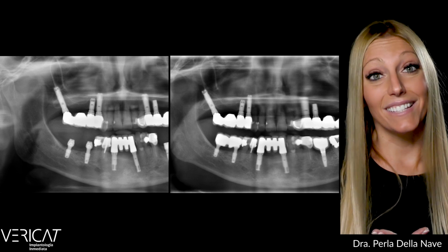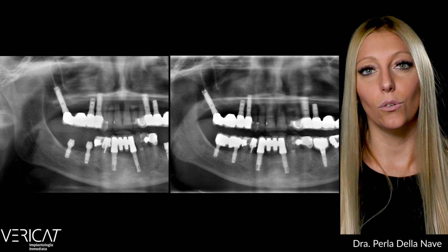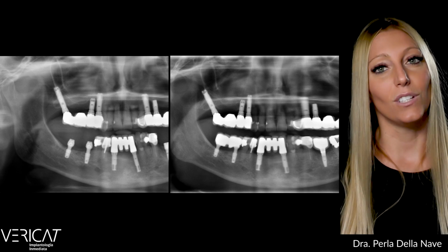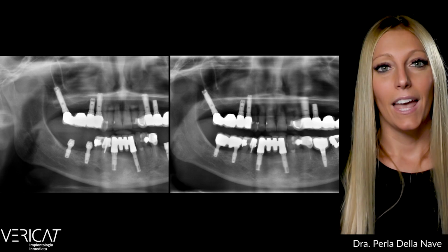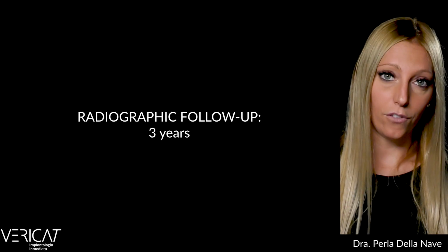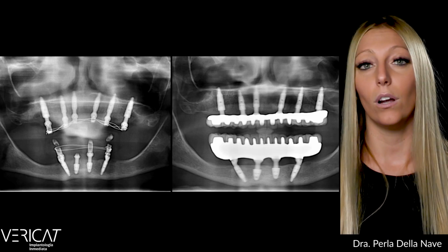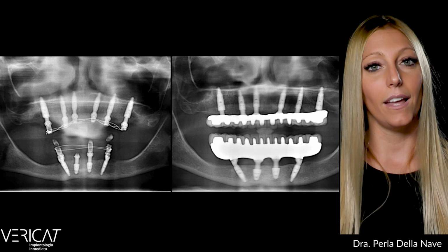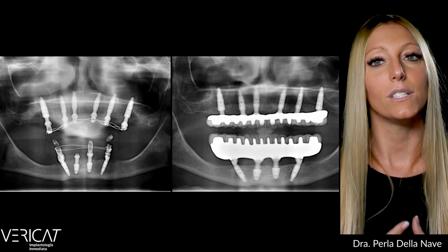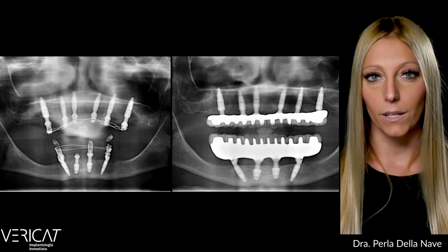The abutments in these cases are essential because they contribute to the maintenance of the soft tissue, which in this kind of cases tends to be quite thin and atrophic, and with it to the stability of the underlying ridges. Finally, let's see some examples after 3 years of follow-up. We look at each one of these implants, for example, in this bimaxillary full arch rehabilitation, and we observe how no exposed threads exist and how bone remodeling has been totally predictable, so that the marginal bone is positioned above the shoulder of all the implants.